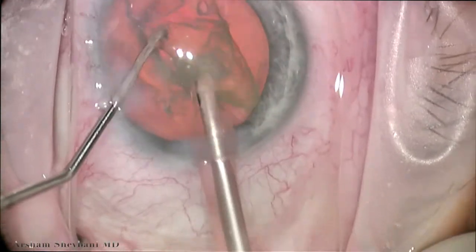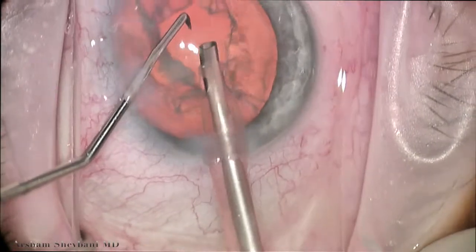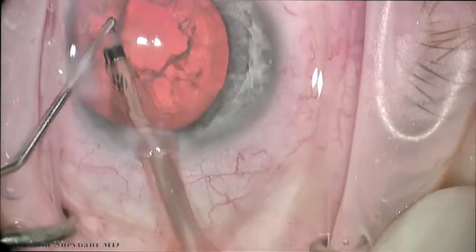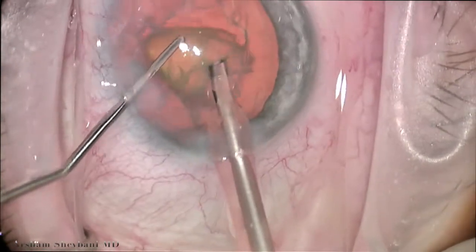Once we remove the initial hemi nucleus, we turn our attention to the other side. This is my preferred FACO technique, just because it minimizes the amount of chops and maneuvers inside the eye. We remove the second hemi nucleus.